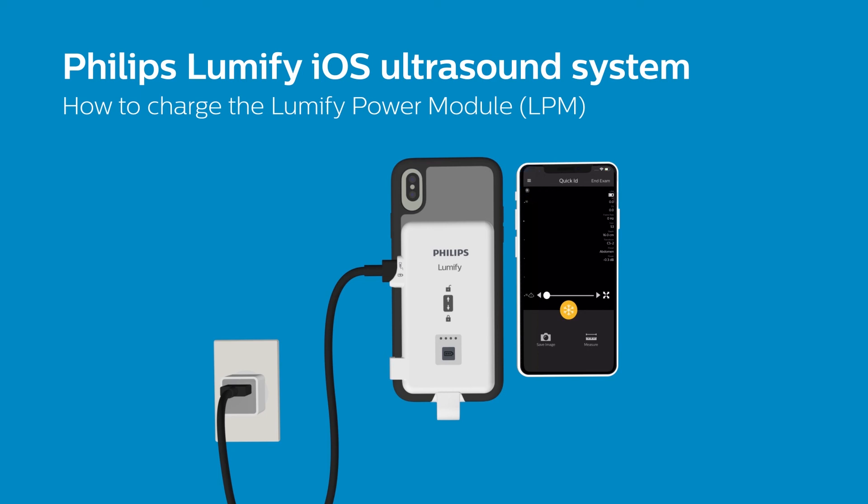If your iOS device supports it, notice the device charging indicator in the top right of your screen. Please refer to the documentation included with your purchase for more information on which devices can be charged in parallel with your LPM.